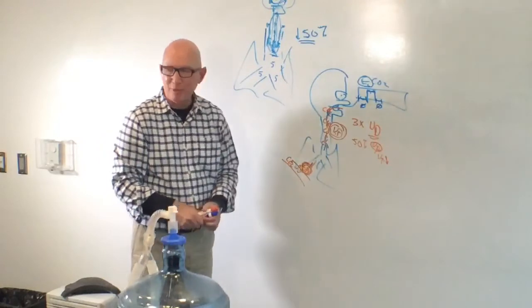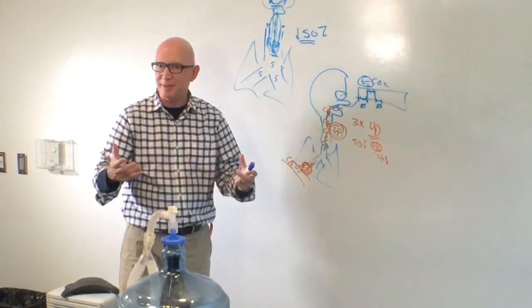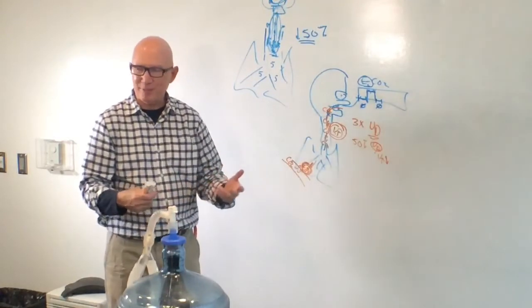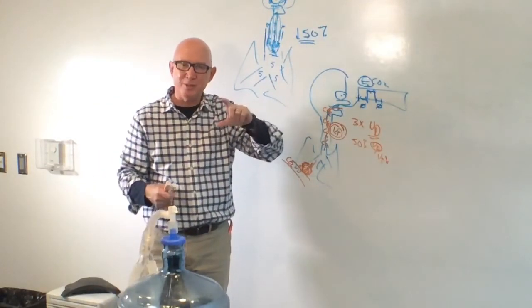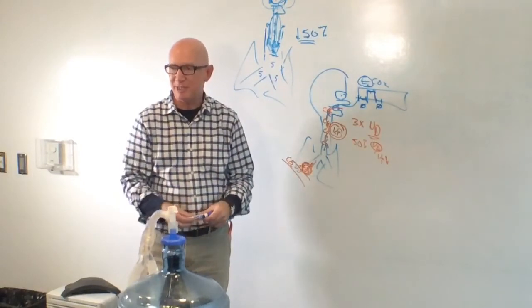So bottom line, it's a reasonable option, but ensure that you're doing everything else that you can do first, because ideally those bits and pieces that you use that create mechanical dead space have a purpose. So the main point is to use the right size for the patient that you have, and in those smaller kids, it's not unreasonable to take away some of that dead space if that's what you need.